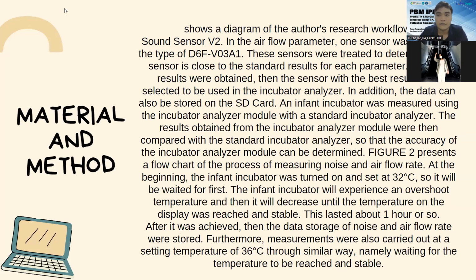This shows a diagram of the research workflow. For the sound sensor V2 and the airflow parameters, one sensor was used, with the type D6F-V03A1. These sensors were treated to determine which sensor is close to the standard result for each parameter. After the results were obtained, the sensor with the best result was selected to be used in the incubator analyzer. In addition, the data can also be stored on the SD card.